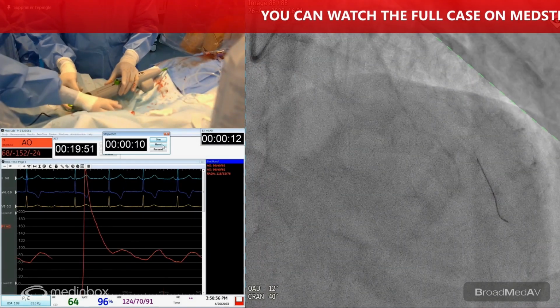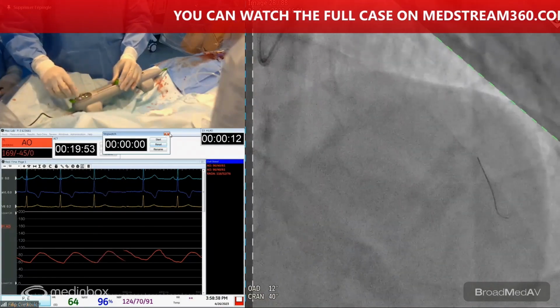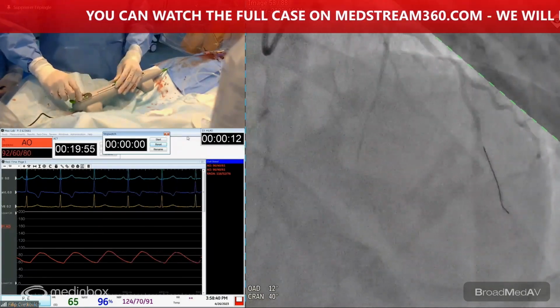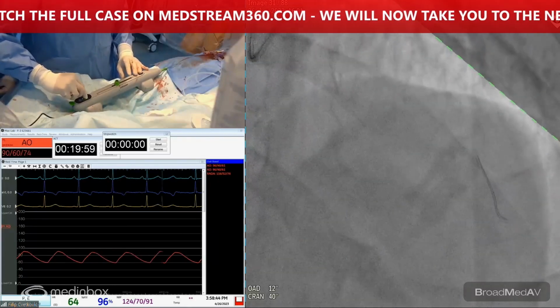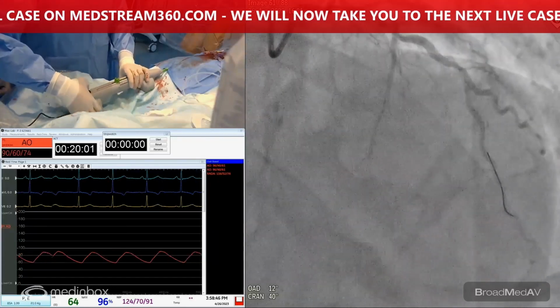So to go out, open the lever. All right. So I hope the RCA was educational enough. And I still have a lot of work to do.